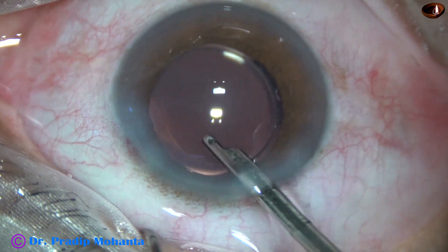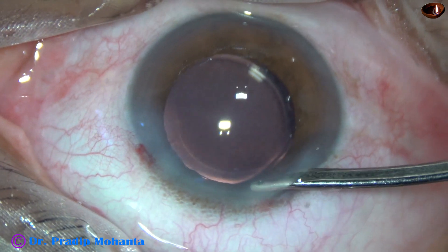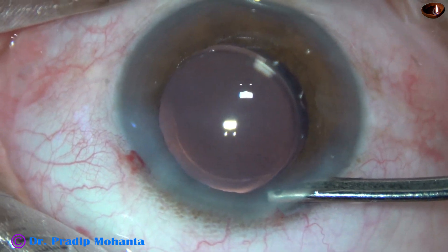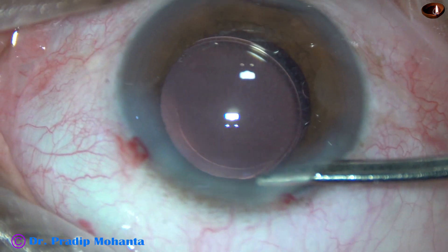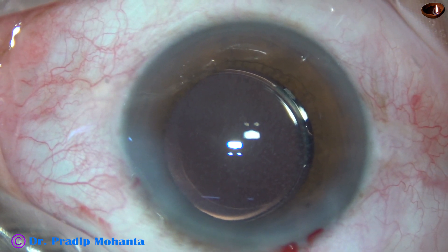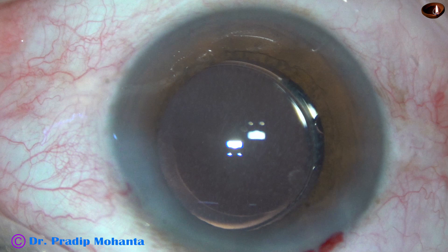There are fine white dot-like, talcum powder-like dots on the posterior capsule. In this view you can see that they are all over the posterior capsule. You can see the white dots very clearly in this view. If you have any idea of what this is, please let me know.